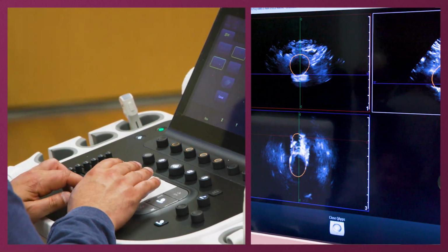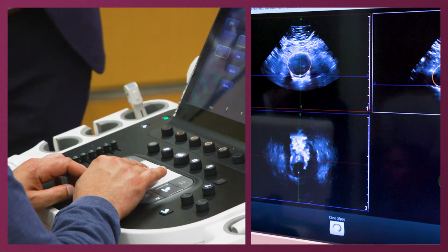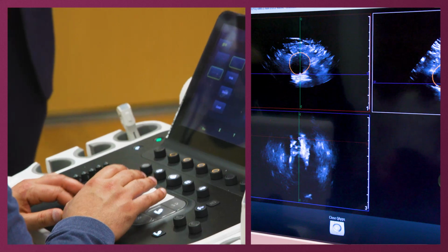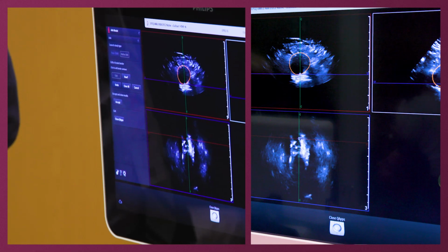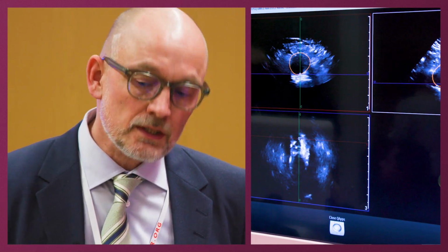Is there a significance to, let's say you have an intramural thrombus? It should be able to see it actually. It looks at the pixels. But as a surgeon, you want to know this data. I mean, you want to know how much lumen is open and how much there is, or you want to know just the total diameter for a follow-up.